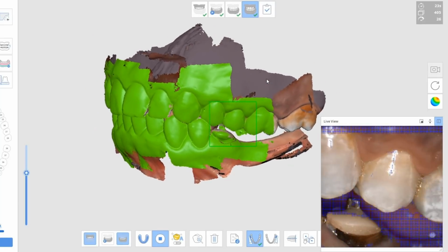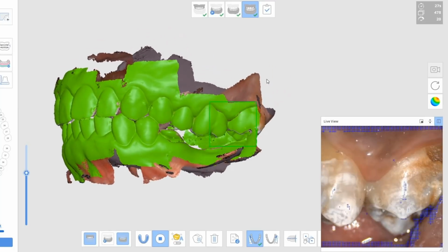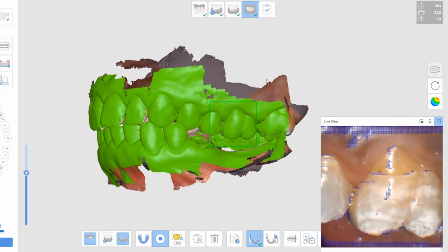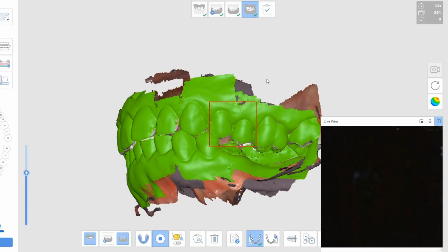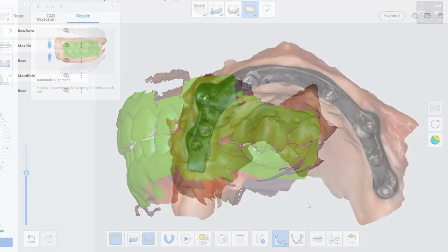Again, here you'll notice that anything that's purple in the lower right quadrant, the live view, is what I've told the software to ignore with my focal length filter or gauge. So that's exactly how I've positioned it so I can block out the tongue.